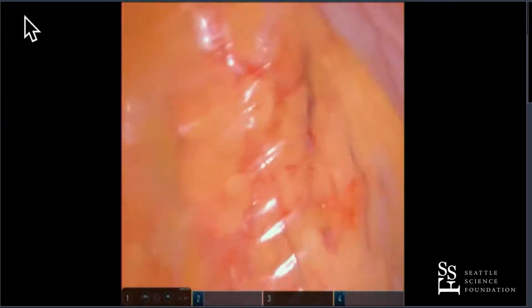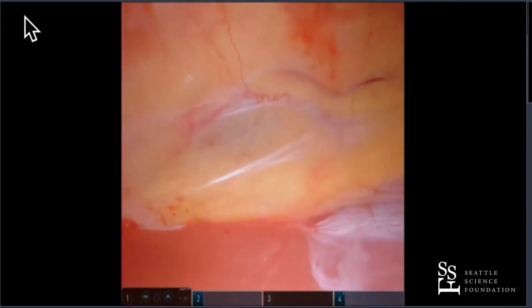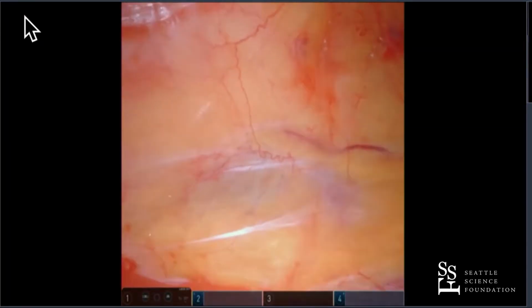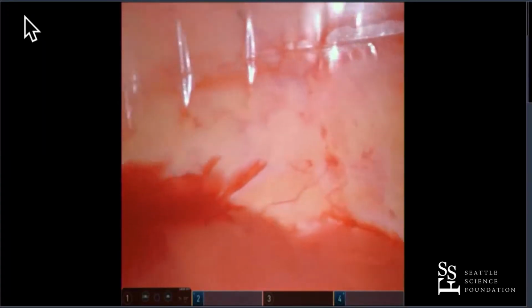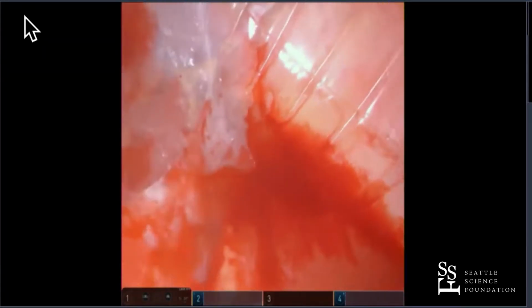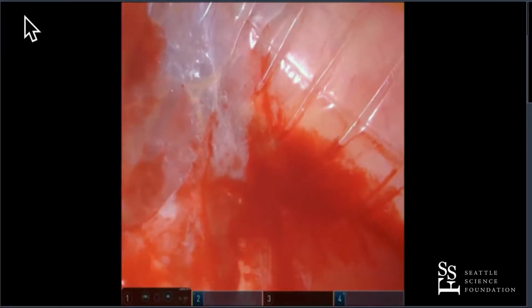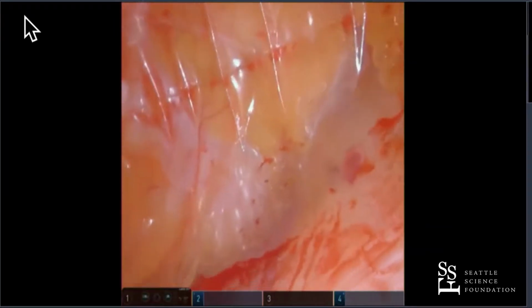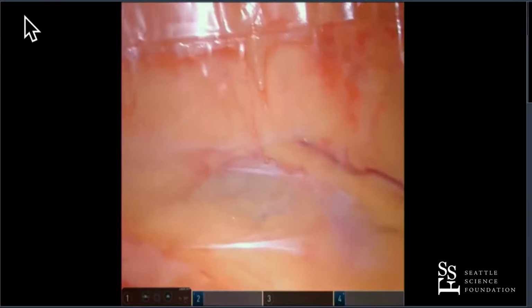Let's go some more, Brando. Keep going, doctor. That's fine, doctor. Let's go with that. All right, so we're just going to let this sit here. We get a little bleeding sometimes. We're just going to let this tamponade a little bit. And so I'm looking up towards the kidney now. Here's the body wall I'm touching right here. And then you come across and you can look down into the pelvis. Okay, this is the balloon down in the pelvis. You can see it's got a thin peritoneum. The bowel's just on the other side of that, so we have to be careful.